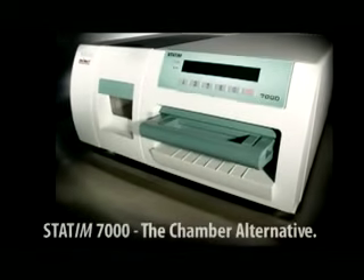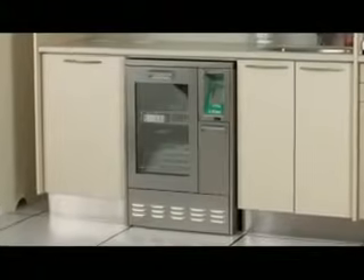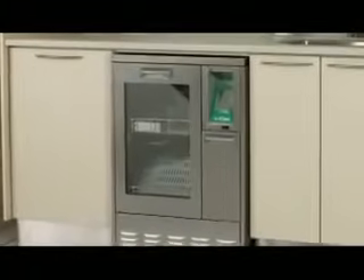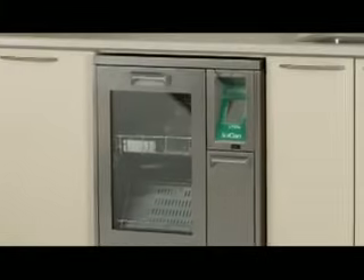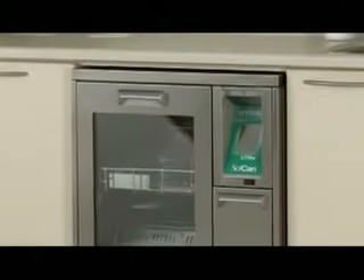The STATIM 7000 is the chamber alternative. Along with STATIM autoclaves, HYDRIM instrument washers provide hands-free cleaning prior to sterilization to offer a total solution for instrument processing. STATIM's Dri-Tec technology is a key part of STATIM's instrument management system. As the industry's leader in instrument reprocessing, STATIM provides innovative, unique, and cost-effective solutions for every dental practice.